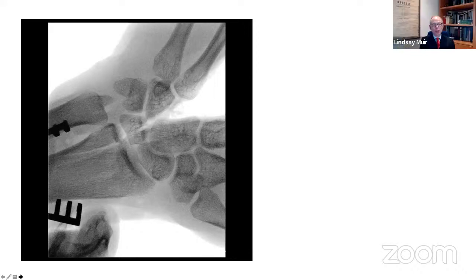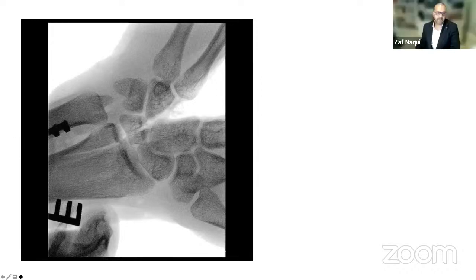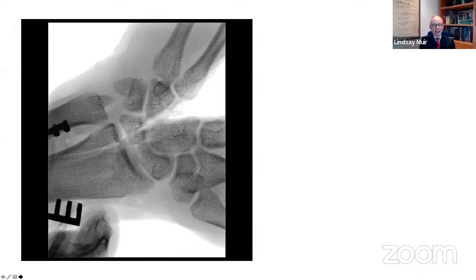Okay, well, it looks to me like he's put his hand up, and he's had a nice, neat incision between the capitate and the hamate, and then a nice, clean bisection of the lunate, carrying on down into the radius. So I guess there's some soft tissue reconstruction required in the hand and intermetacarpal ligaments. The radius fracture on the basis of that doesn't look too scary.